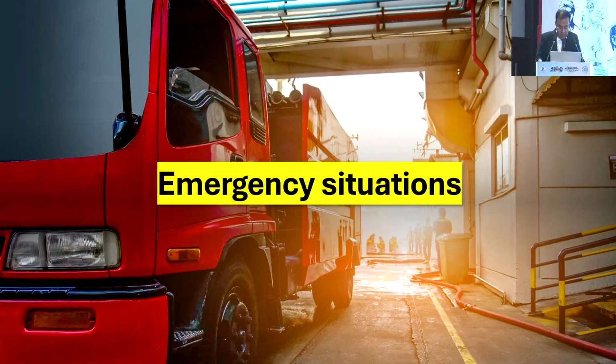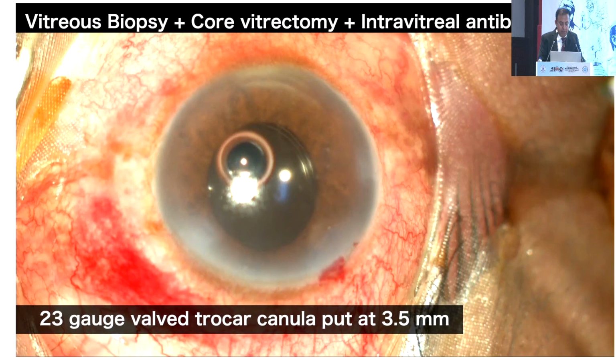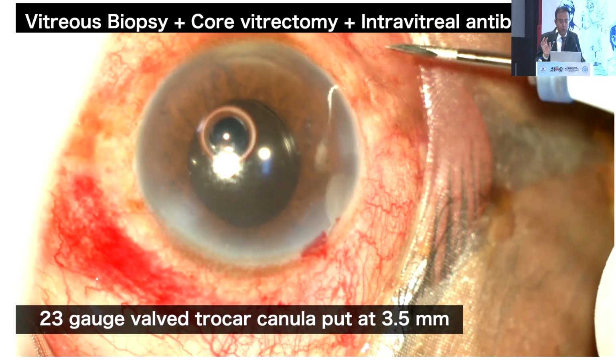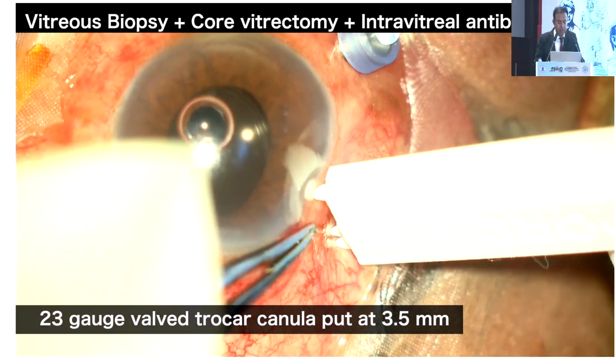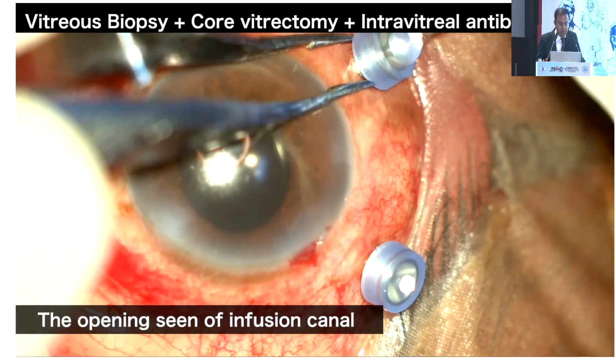And now a last video for people. Sometimes we have endophthalmitis. We need to know the basic steps as to how to inject the antibiotics. This is a 2-port vitrectomy with valve cannulas. My anterior segment surgeon is only doing it. You can see I have put the 2 trocars.